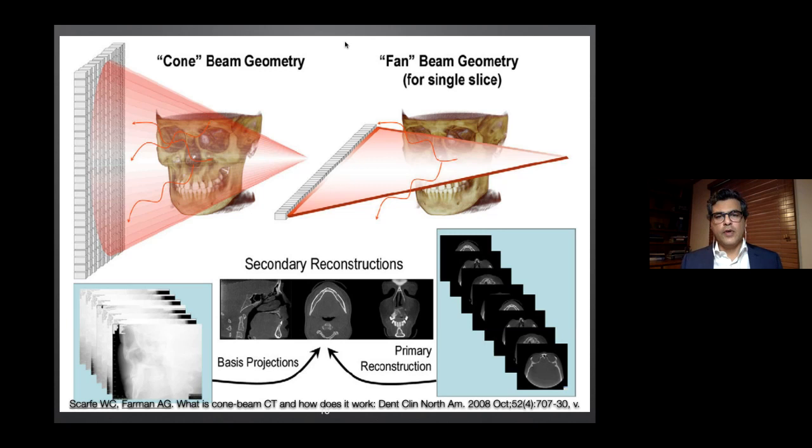That said, when cone beam CT came, we did not have any reference for it among the different imaging modalities that we used in dentistry. We still use them, for example, intraoral imaging, panoramic imaging, and cephalometric imaging. So cone beam CT cannot really correlate with any of the imaging modalities that we are used to as dentists. The closest comparison that can be done is with conventional CT. That's why we have to bring that in.